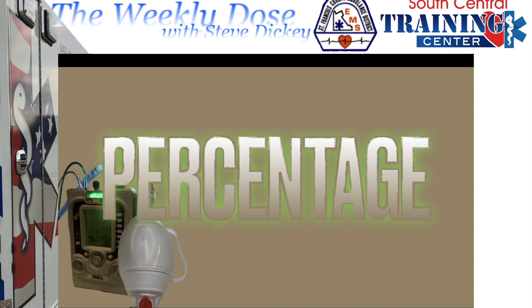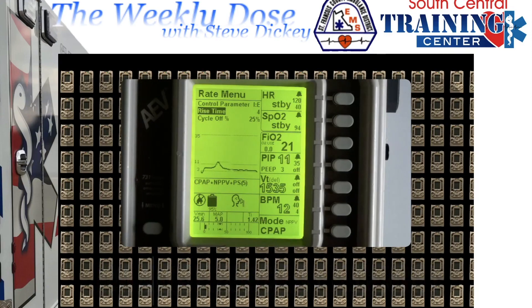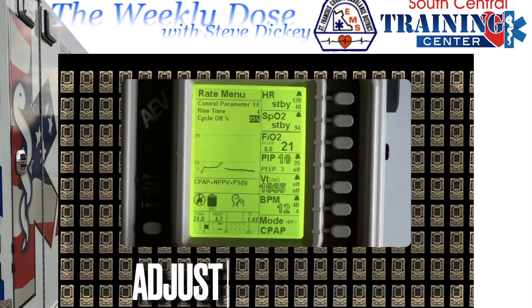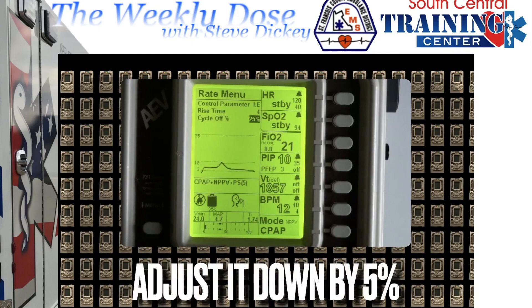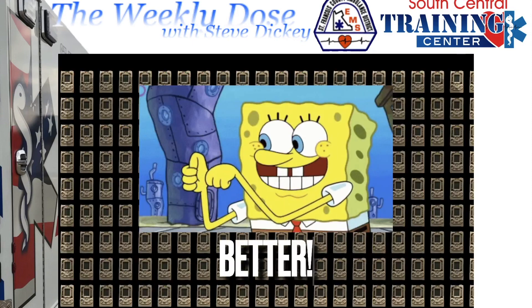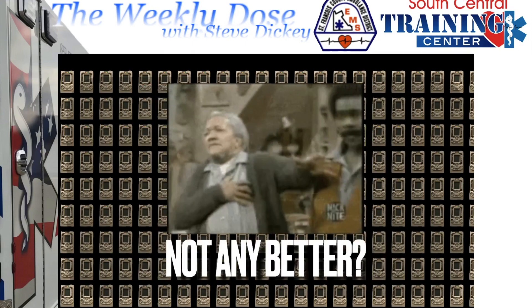Now we're going to adjust the cycle-off percentage. Remember, the default is 25%, and in this situation we're going to decrease it by 5% at a time. See if they get any better. How about now — any better? Good — let's let it ride. Not any better?